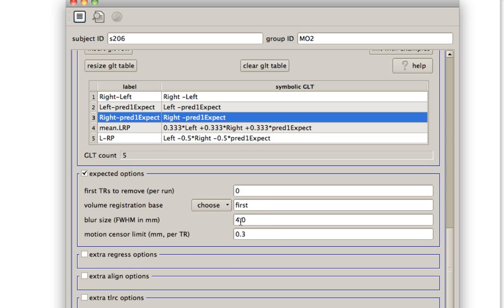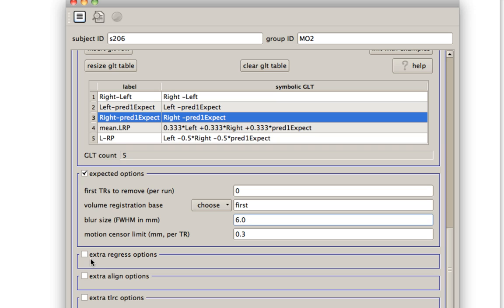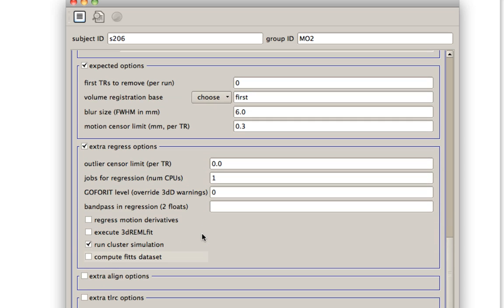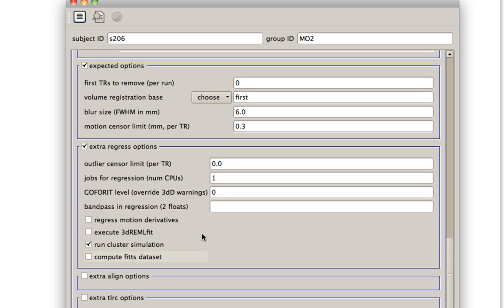Might increase the full width half max to six. Everything else is fine. And what censoring will do is if there's any motion above this millimeter limit, then it'll censor that time point and it will not enter that into the GLM.